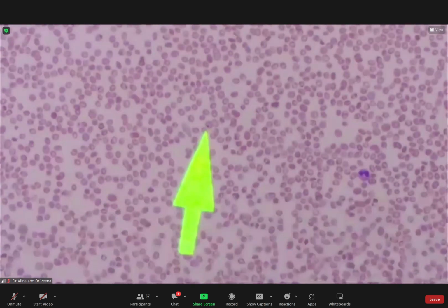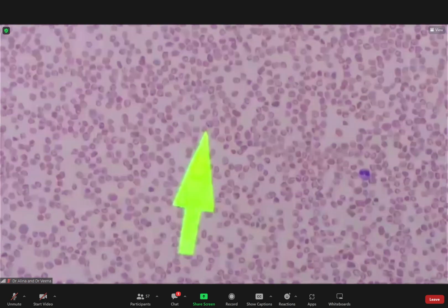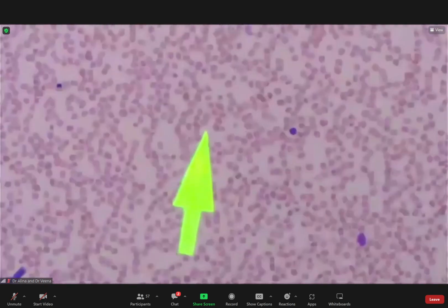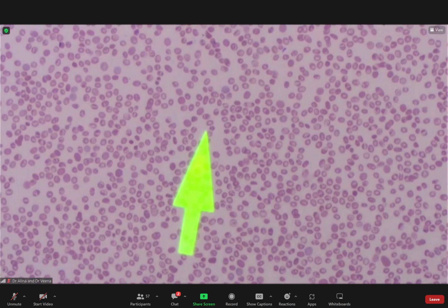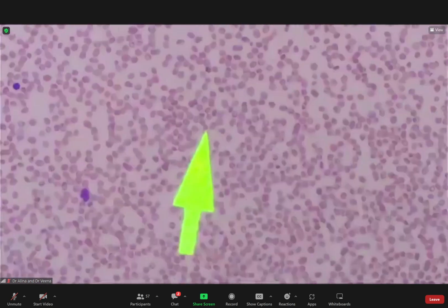Okay. What are they? Howell-Jolly bodies, right? Okay. So the patient has Howell-Jolly bodies and numerous nucleated red cells. This is not just simple thalassemia, right? This patient also coincidentally has post-splenectomy changes.